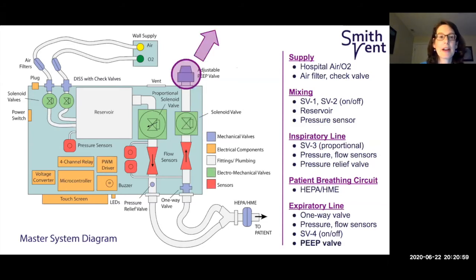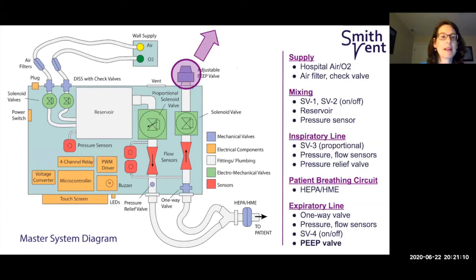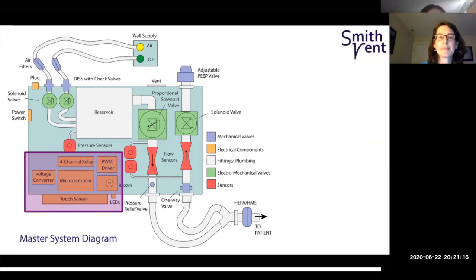And the last stop on this airflow journey is the PEEP valve, which provides a small amount of back pressure to help prevent the alveoli from collapsing. After going through the PEEP valve, the expired breath then joins the ambient air. And now I'll turn it over to Dan to explain the electrical components that control the whole system.